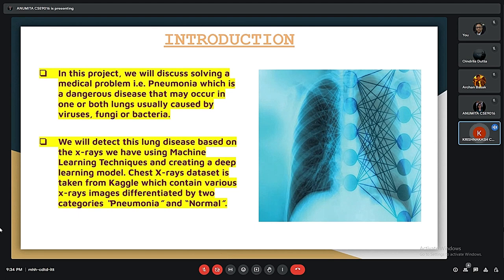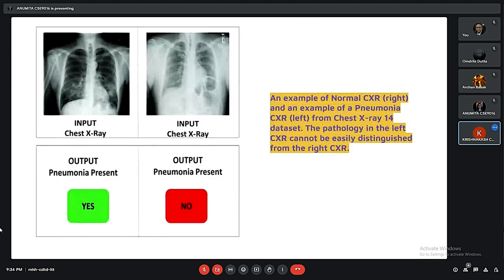The chest X-ray dataset is taken from Kaggle, which contains various X-ray images differentiated by two categories: pneumonia and normal. Here is an example of a normal X-ray on the right and an example of a pneumonia patient's chest X-ray on the left. The pathology in the left image cannot be easily diagnosed compared to the right.